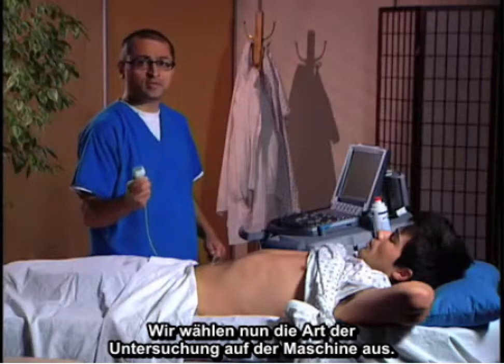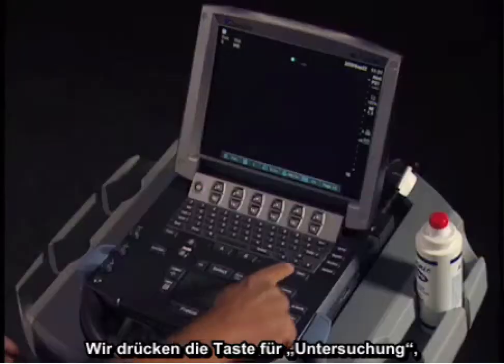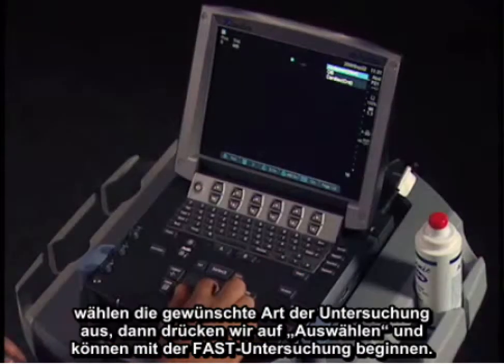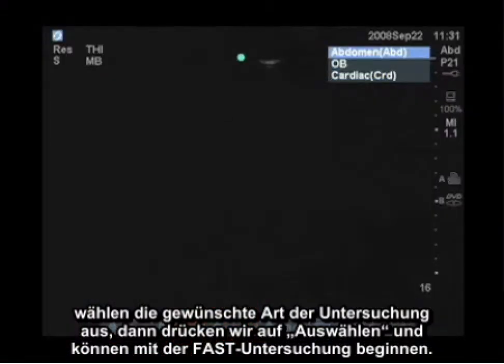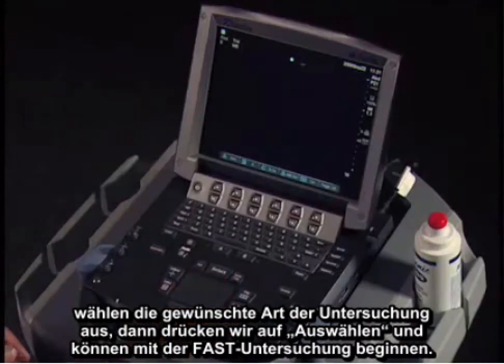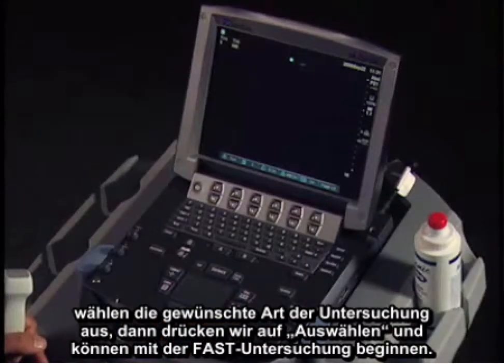Now we're going to choose the exam type on the machine. We'll hit the exam button, choose the type of exam that we want, hit select, and we'll be ready to start the FAST exam.